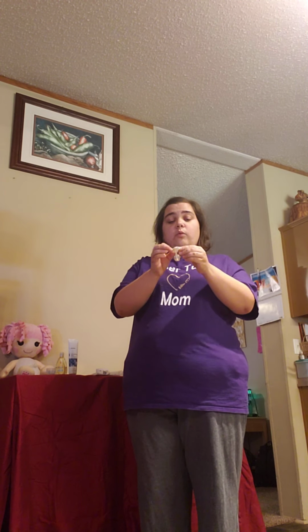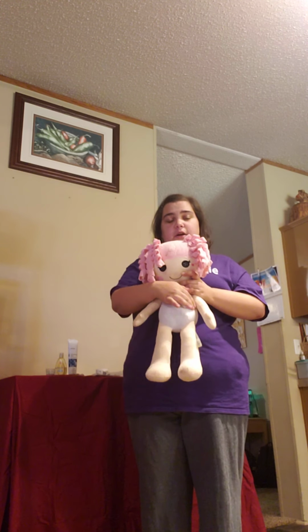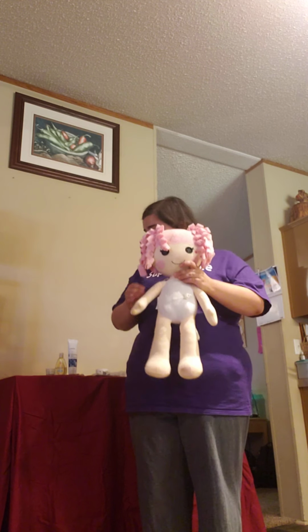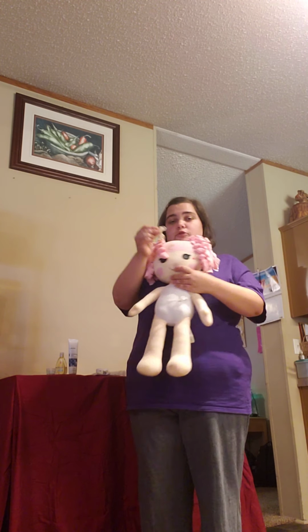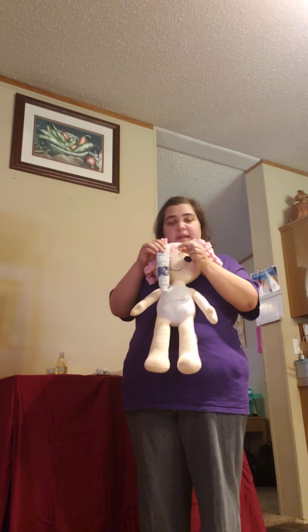Changing the tube every 6 months is a very crucial part of caring for a feeding tube. You will first want to start by gathering your supplies and checking the replacement tube for any form of malfunctions, such as a hole in the little balloon. Once that is complete, you will start by removing the water from the balloon and removing the old tube. When the old tube is removed, you will want to clean the entire area around the open incision and dry it before placing the new tube. Before the new tube is placed, you will want to get your lubricating jelly and lubricate the tip to make the tube easier and more comfortable while being inserted.